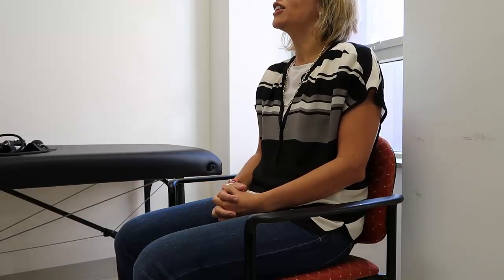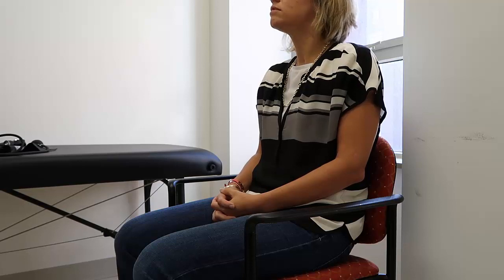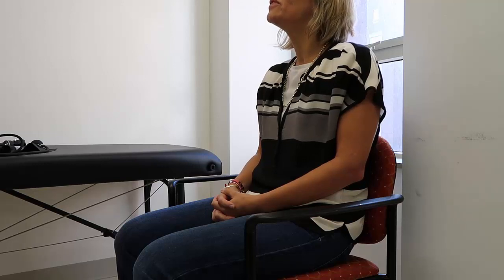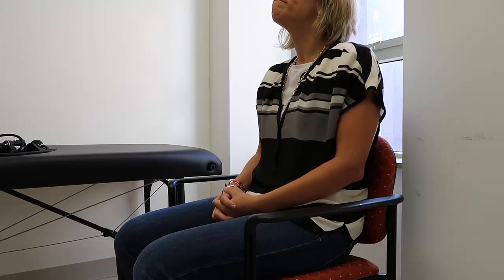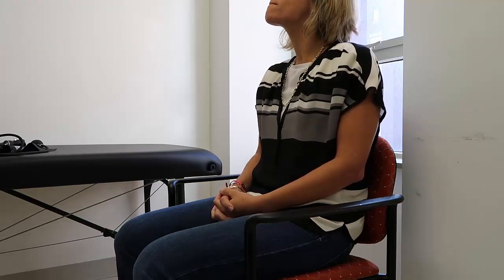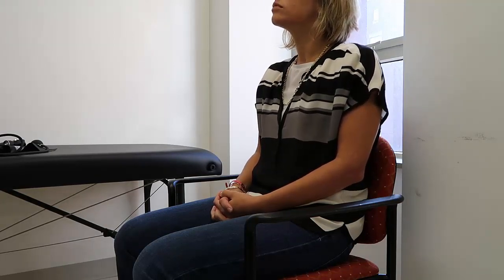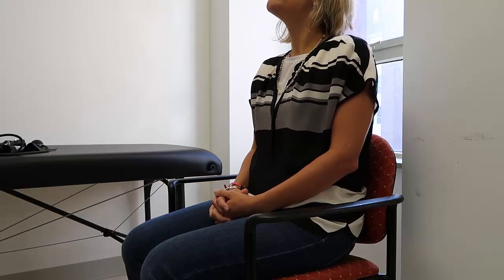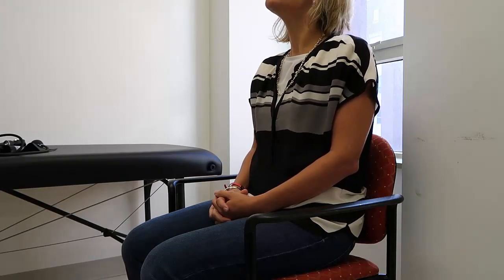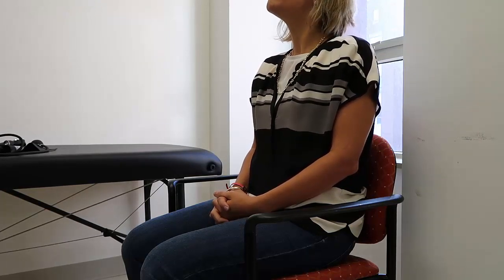Hi, Ms. Smith. How are you doing today? Good, thank you. I'm going to be doing your blood pressure, so I just have a few questions before I start. Have you had any coffee today? I have not. Do you smoke? I do not. And have you had any exercise in the last 30 to 60 minutes? No. I asked these questions because caffeine, smoking, and exercise can actually elevate your blood pressure and affect your reading. So now I'm going to ask you to sit up straight in the chair and keep your feet flat on the floor.